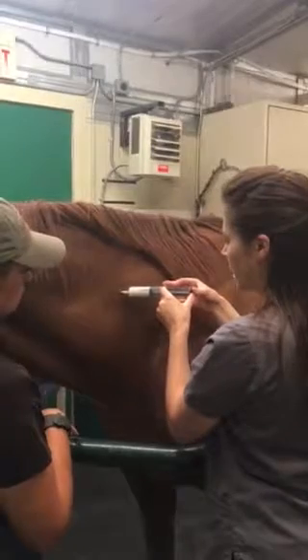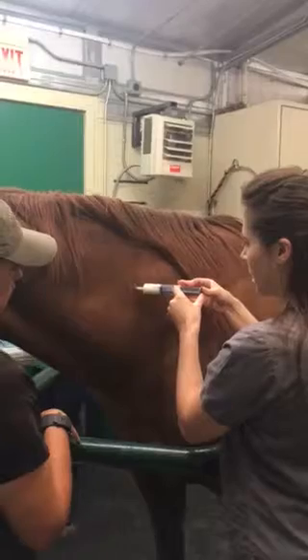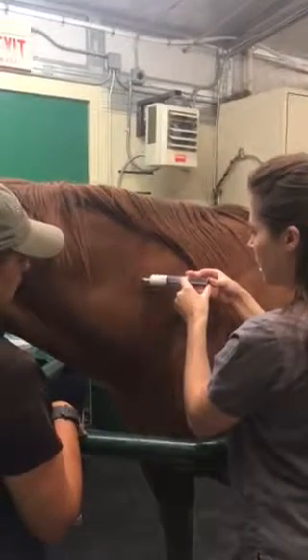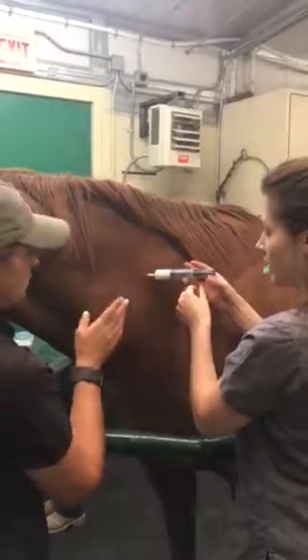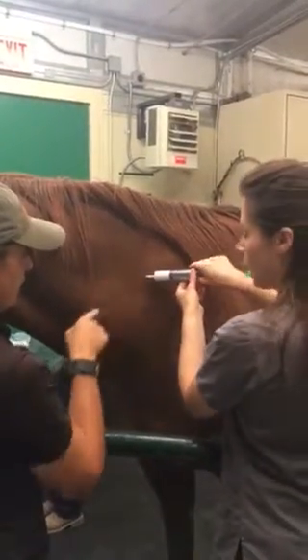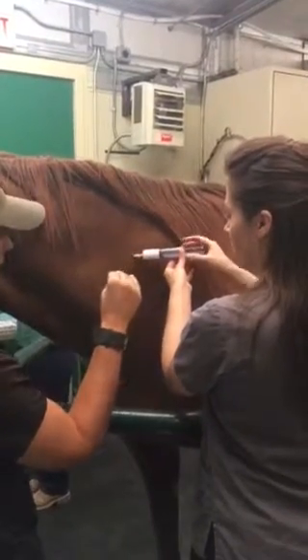We still want to look at her, because one of two things is going to happen. Either that second follicle took off and we might have that other pregnancy in there that we want to look for. But at the same time, if not, if she's coming back in, now is the time she would be coming back in.